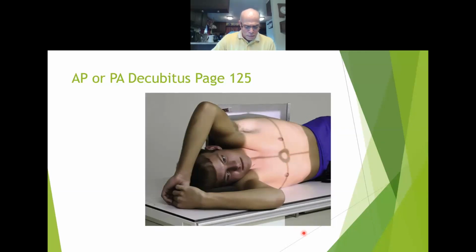Place the patient in a lateral decubitus position lying on either the affected or the unaffected side as indicated by the existing condition. A small amount of fluid in the pleural cavity, or pleural effusion, is usually best shown with the patient lying on the affected side. Pleural effusion means that there is fluid in the lungs. With this position, the mediastinum shadow and the fluid do not overlap.